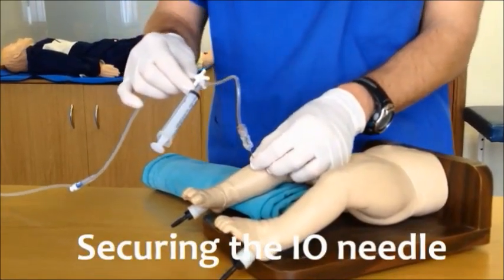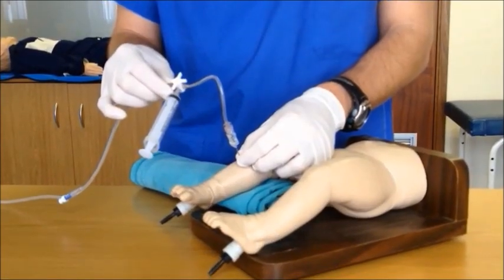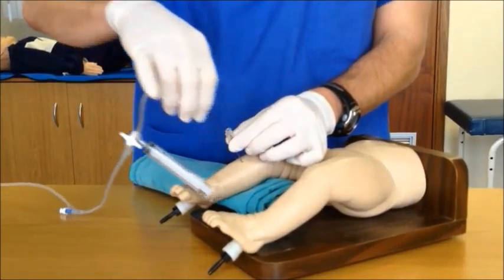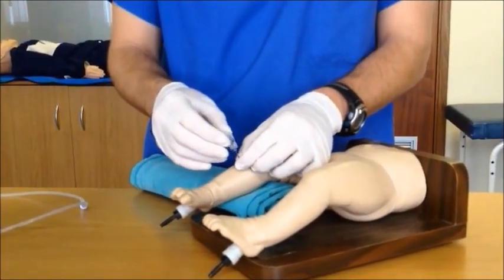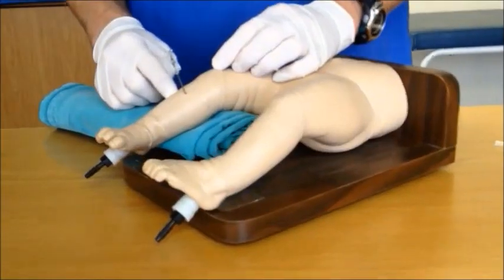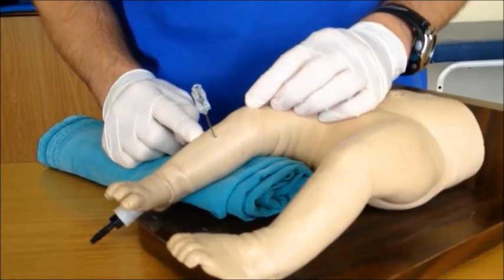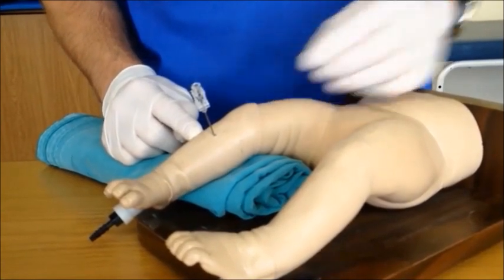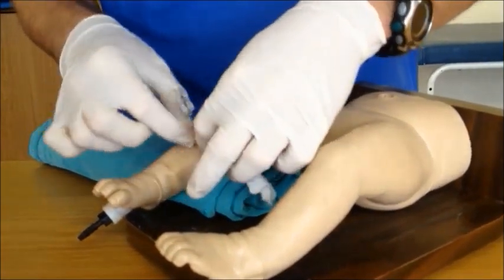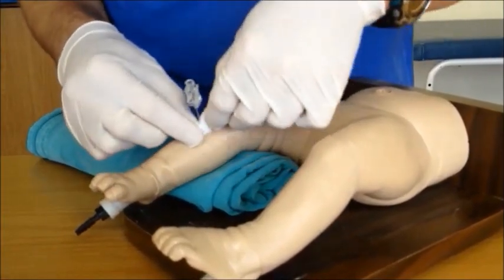Once all initial life-saving medications have been delivered, securing the intraosseous needle is an option. In order to demonstrate one technique for doing so, I will now remove the giving set from the back of the needle — but please note that when you are actually doing the procedure, you would not disconnect and would have an extra assistant to help you. All techniques for securing the needle to the patient's leg carry the risk of dislodging the needle or increasing vascular compartment pressures. One technique that has been described starts with a roll of gauze placed against the skin at the base of the needle to protect the skin from any pressure.